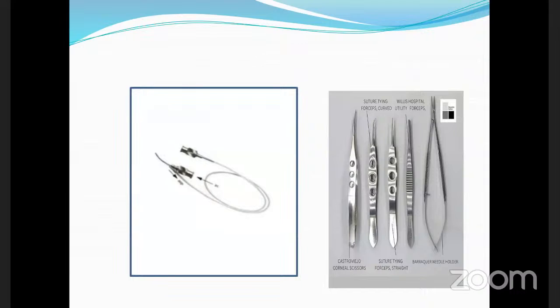The aspiration port is always on the tip of the cannula, and the irrigation port is on the lateral part of the cannula. So normally what we do is we aspirate from this tip and irrigate from the lateral part of the cannula. It is a direct Simcoe cannula, but there are reverse cannulas also.